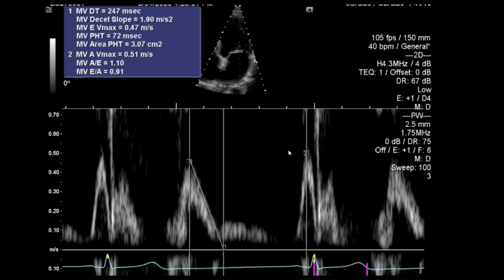Moving on to the mitral inflow parameters, looking at the various diastolic parameters. When looking at a Doppler signal I'm trying to make it about two thirds the size of the window if possible, and also see a little bit below the baseline as well. Looking at the E wave, the A wave, and the deceleration time — often I'll try to centre what I'm measuring as much as possible.